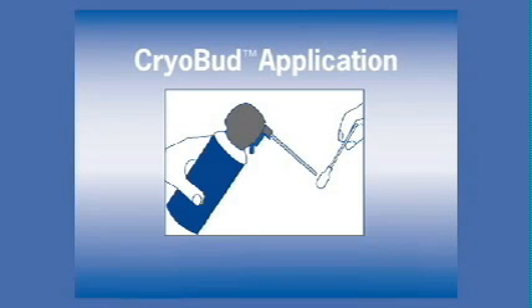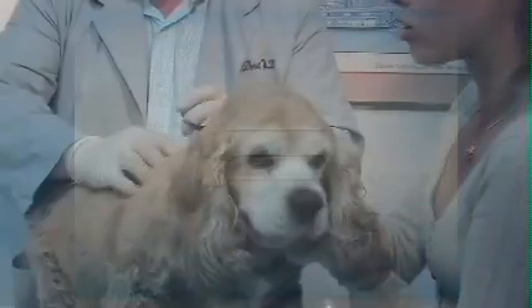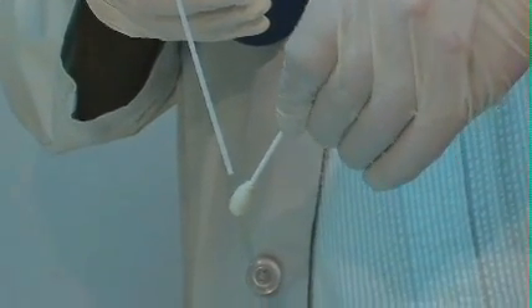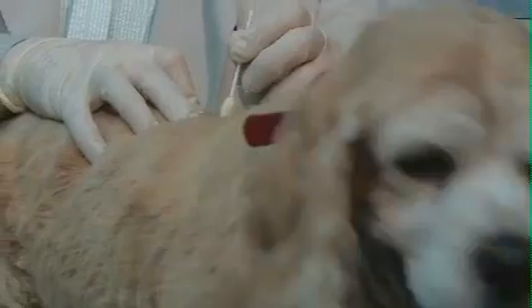In this case study, the patient has been diagnosed with a wart. The cryobud has been chosen as the method of application for this procedure. Cryobuds are foam tip applicators best used for treating hard-to-reach or bony surfaces of the body, but can be used in place of the limiting cones. The patient is properly positioned and the appropriate bud is chosen. While holding the canister in one hand and the cryobud in the other, apply gentle pressure to the trigger nozzle and lightly spray the cryobud. Saturate the bud to its first drip point. Place the frozen bud onto the patient's lesion and hold firmly for 25 to 30 seconds.